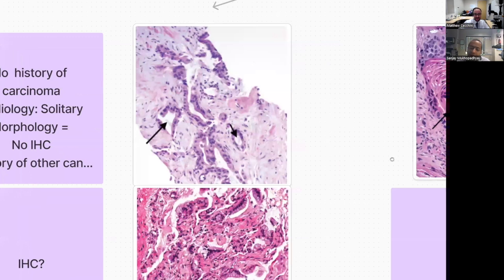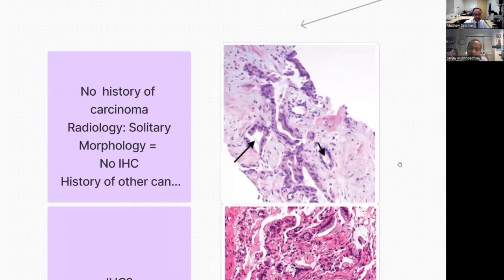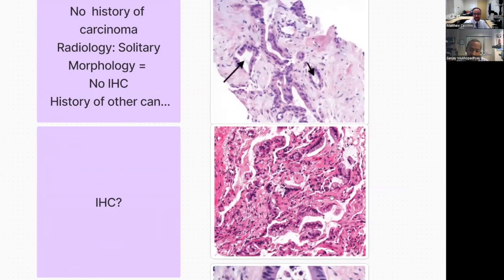So I think for me, the two main things are: history is super important here, and second, just because something is TTF negative does not mean that it is not a lung cancer. It's great.